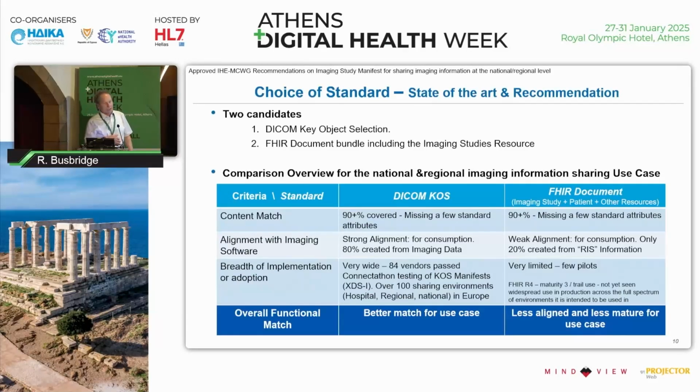The other category we looked at is how we actually use this thing. What are we using it for? Typically, the manifest is used in an imaging environment. Imaging environments are, by default, DICOM. They have a DICOM stack to parse the contents, use those contents, and encode the contents. So in terms of imaging, a DICOM KOS object aligns very well into that DICOM stack. It is a DICOM object, so you can parse it, extract information, and create it. Based on those three categories, at least, the overall match is for the DICOM KOS, and we've chosen that. We recommend that as a way forward.